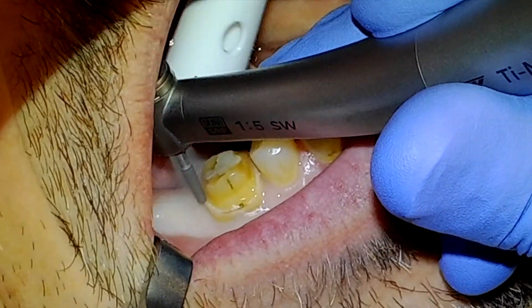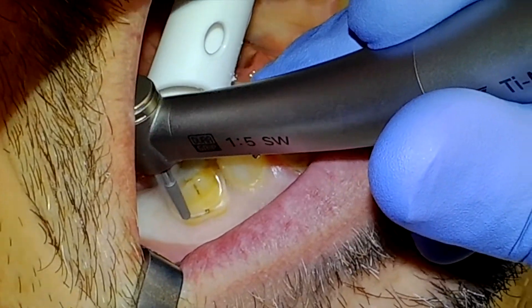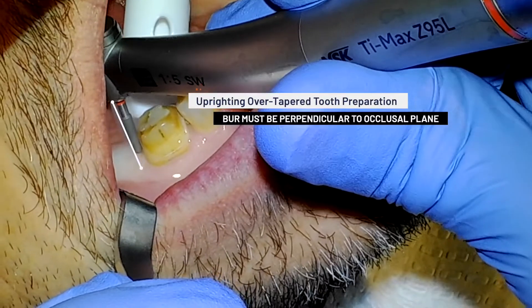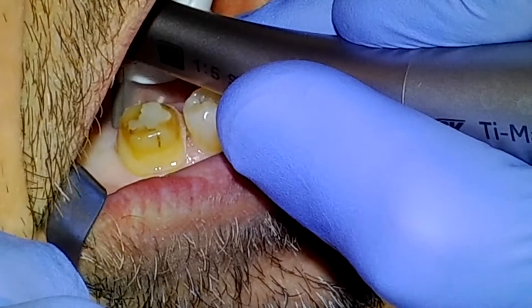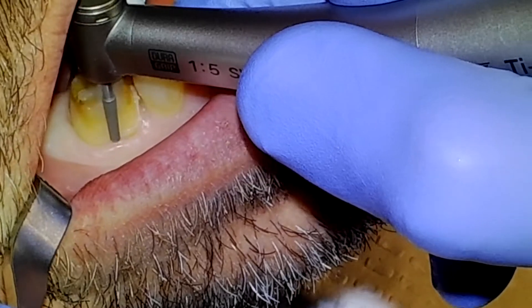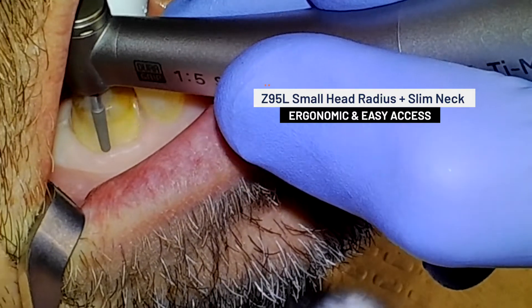With several millimeters of thick enamel remaining circumferentially, I have my NLZ motor set at 200,000 RPMs. Uprighting an overtapered tooth preparation in the posterior requires that I position the burr perpendicular with the occlusal plane of the teeth. With many electric handpieces, this would be a daunting task. However, the small head radius and slim neck of the Z95L make this endeavor surprisingly easy.